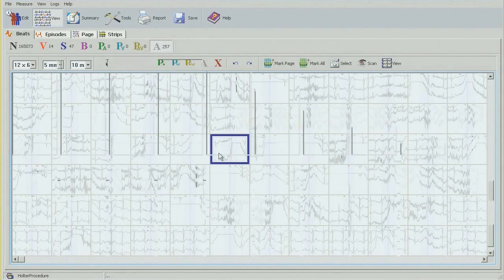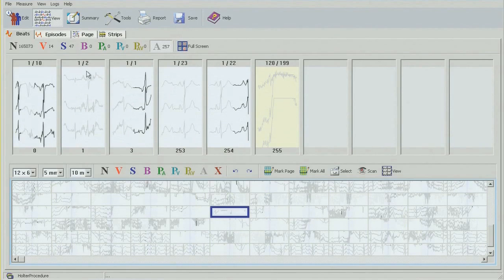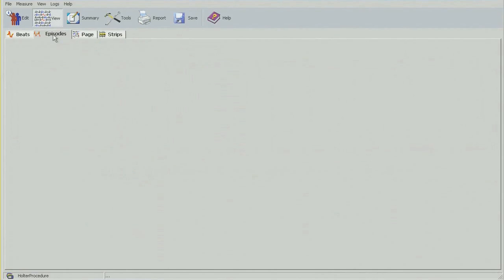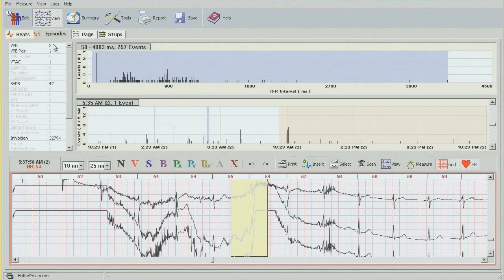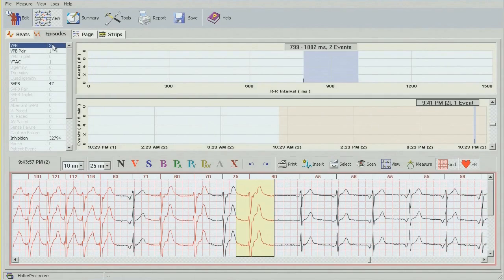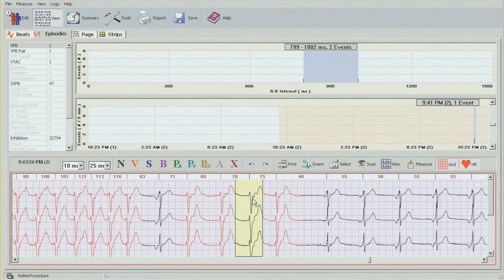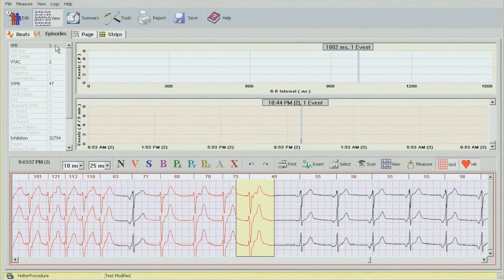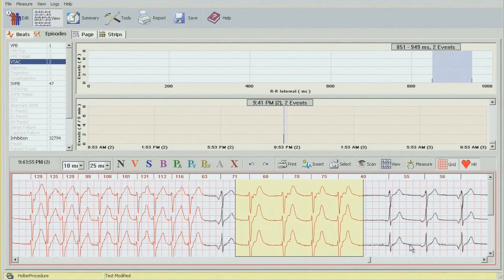At this point I'm pretty much finished with all the editing. Next we're going into episodes mode. In episodes mode we have two ventricular beats — this one is actually part of a run, so I'll change that beat to ventricular. That leaves us with one isolated ventricular beat, two runs of ventricular tachycardia — actually one run of VTAC and one run of accelerated ventricular rhythm.